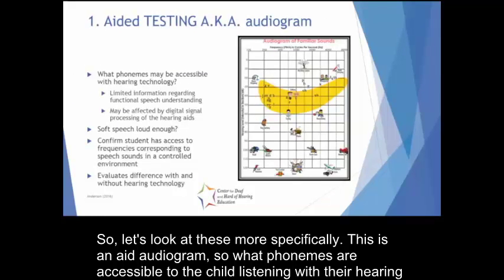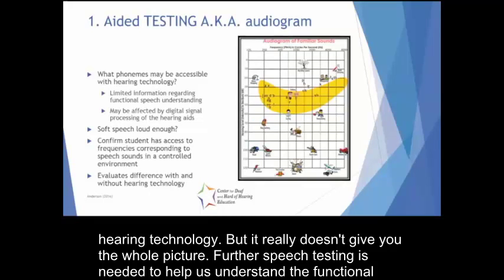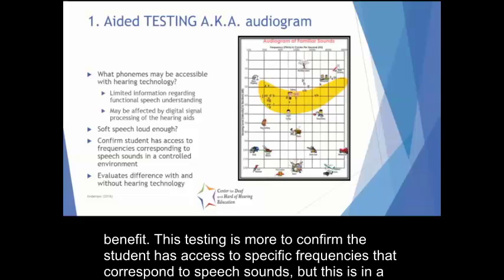This is an aided audiogram. So what phonemes are accessible to the child listening with their hearing technology? This is a helpful validation tool. It helps you get a basic understanding of what the student has access to when they're wearing their hearing technology, but it really doesn't give you the whole picture. Further speech testing is needed to help us understand the functional benefit.